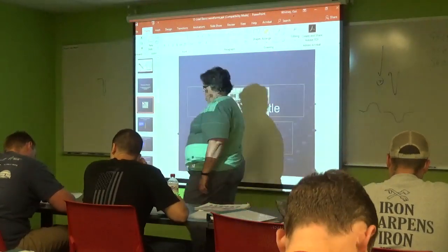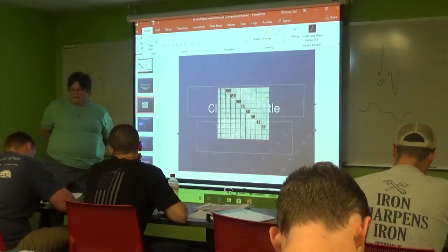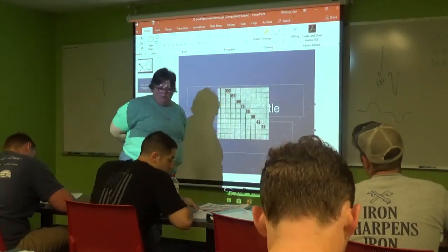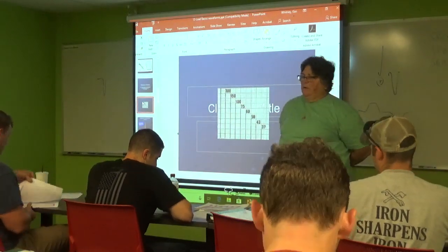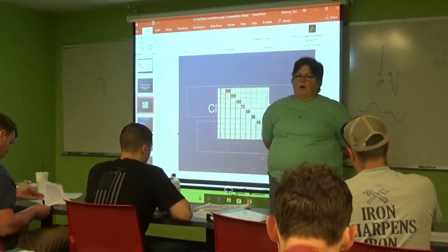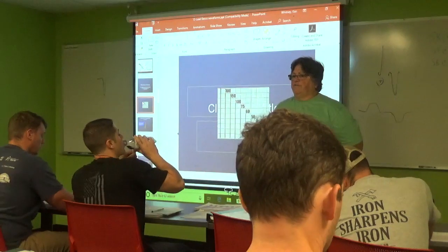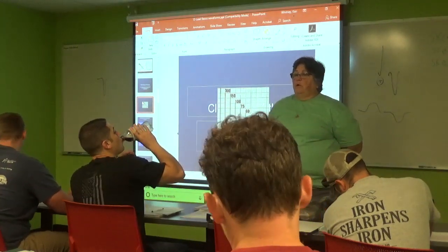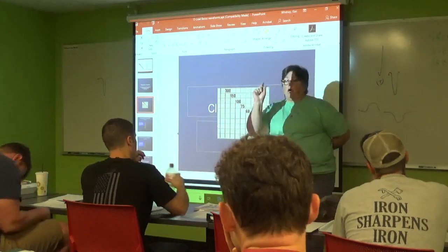On our flow sheet, what comes after axis? After intervals. It is imperative that before you even start to look for your MI, and this is where all the mistakes get made in the field, you have to look at intervals. We went through intervals our first day by talking about what should be a normal PRI.